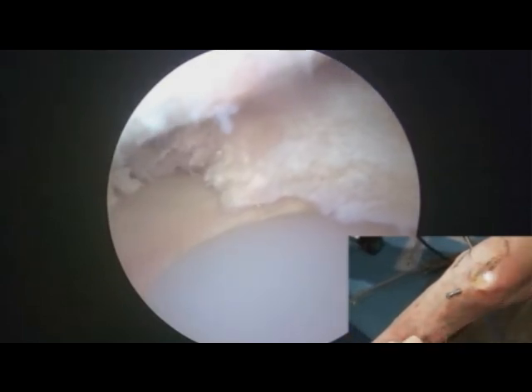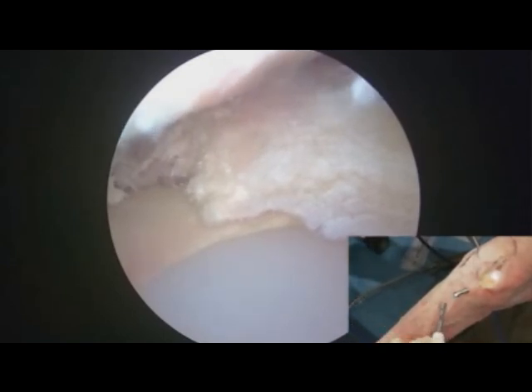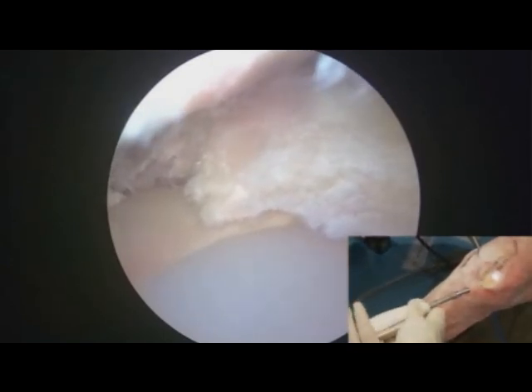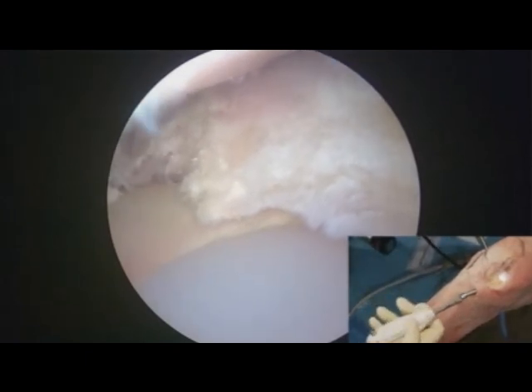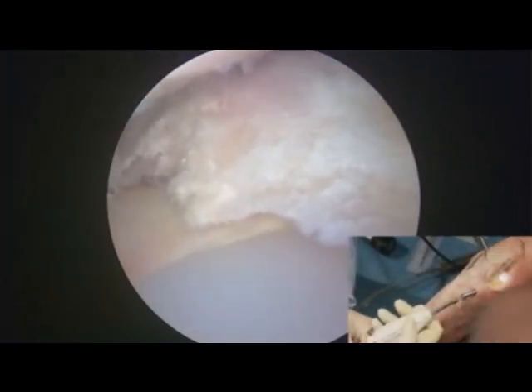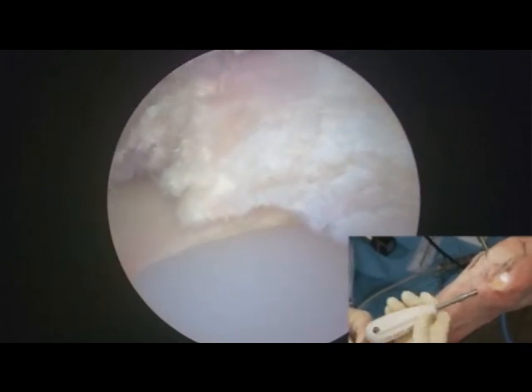Do you want to show the cementing now? We don't cement this right at this position now, but I'm just going to show you how I take everything out so that it's all done and you don't have to worry about it. So what I do is I take the metal screw out, just pull on those sutures, please. Thank you. And I just re-thread them back through the screw so that we keep on line.